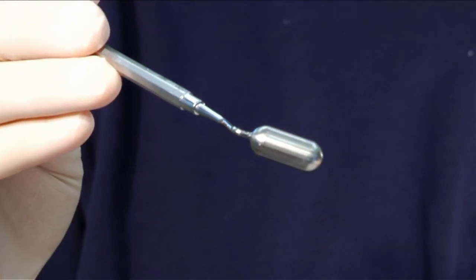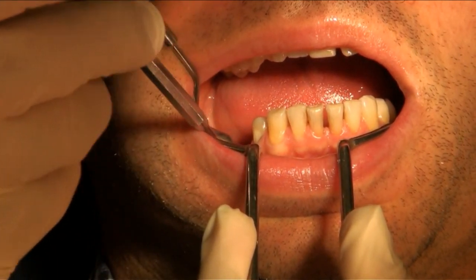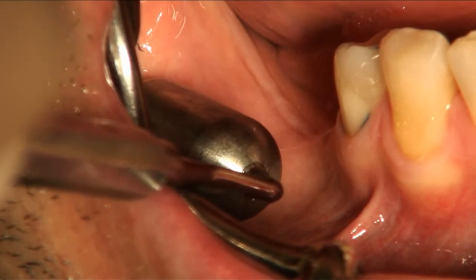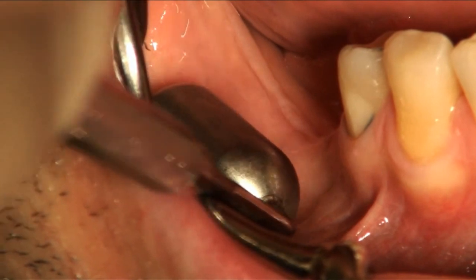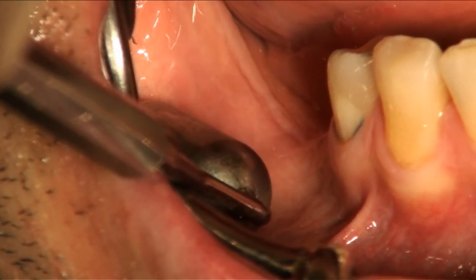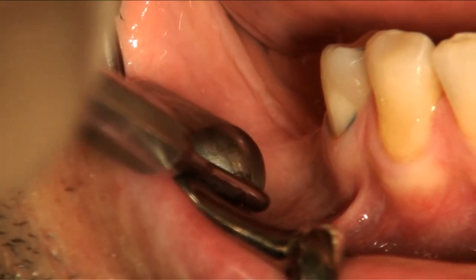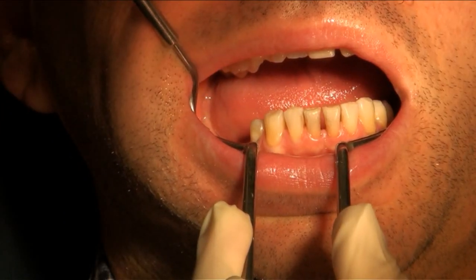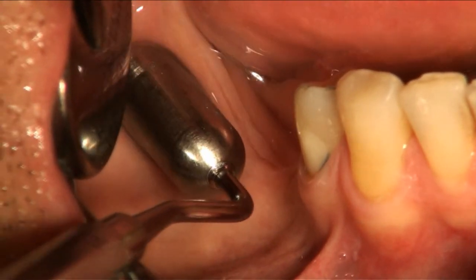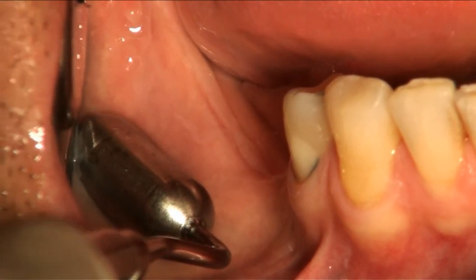The appropriate size of the expander is selected using a surgical template. This side of the template corresponds to the final volume of the expander. This is the final volume of a 1.3 milliliter expander, and as you can see, the final volume might be too big because the expander might come into the ascending part of the mandibula. So we will try a smaller expander, for example, 0.7 milliliters. And this expander may be appropriate.